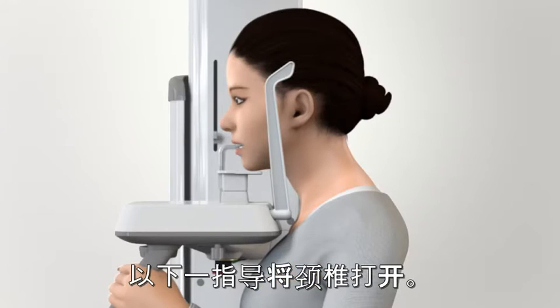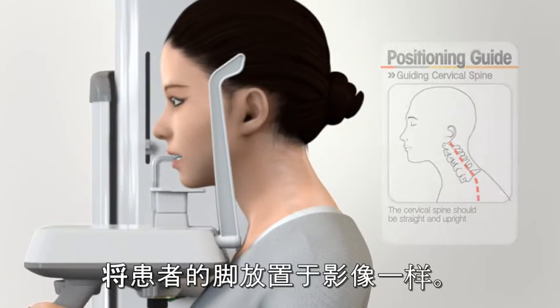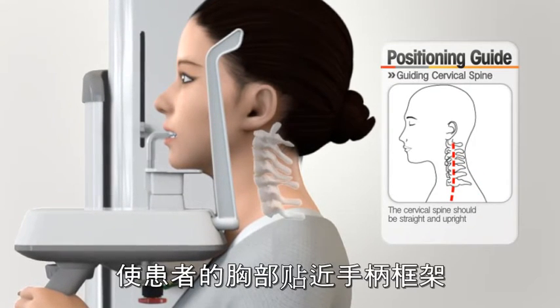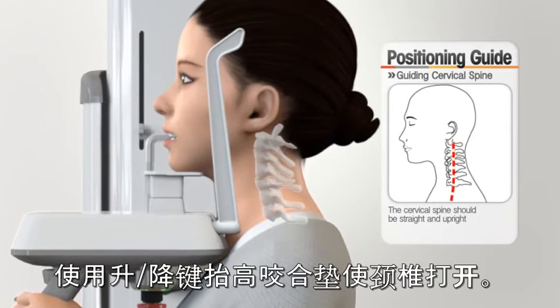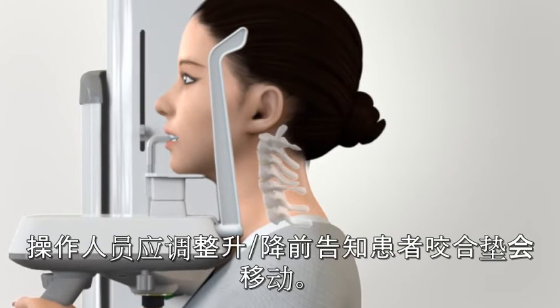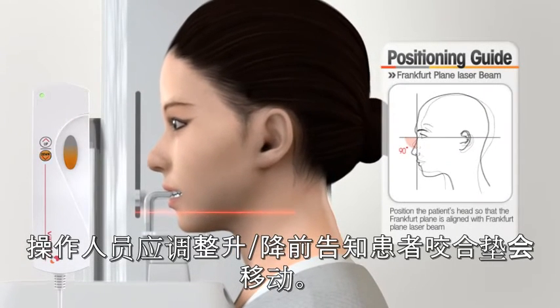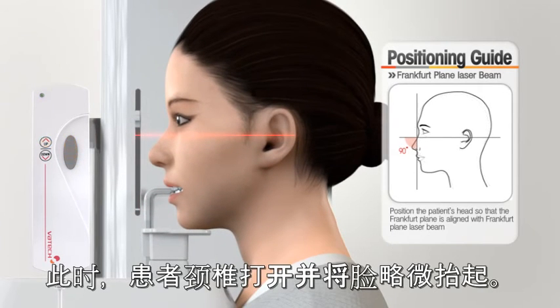Bring the patient's chest close to the handle frame. Using the up-down switch, raise the chin support so that the patient's spine can be properly stretched. Before pressing the up-down switch, the operator should inform the patient about the movement of the chin rest and control the switch. At this time, the patient should be stretched up and the patient's face is raised slightly. Match the patient's Frankfurt plane at a level with the Frankfurt plane laser beam, adjusting the height of the chin rest.